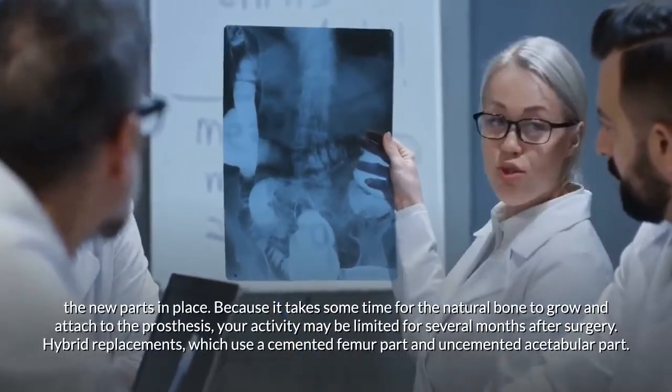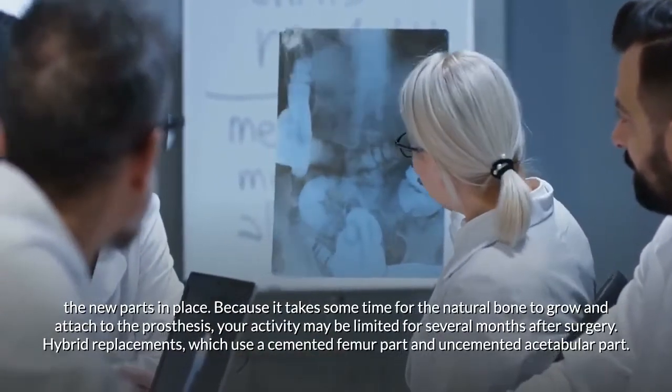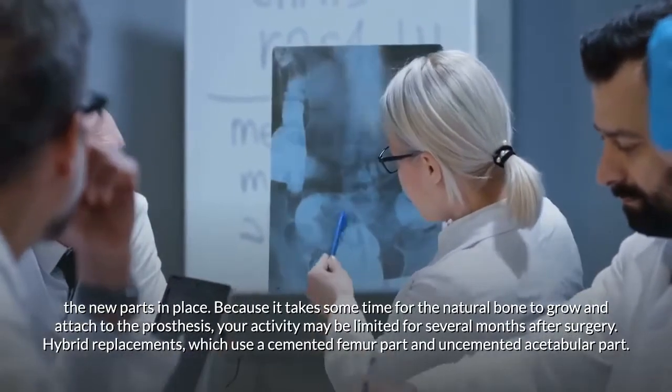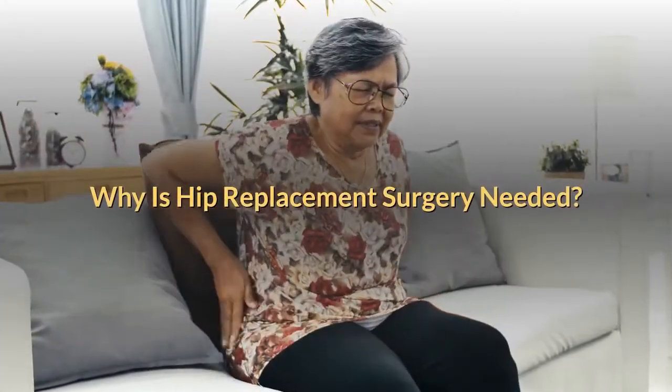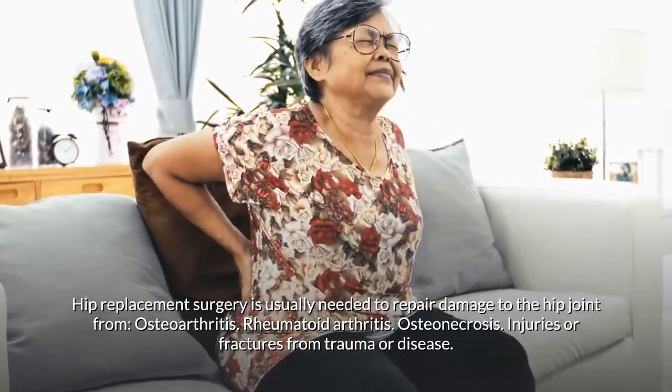Because it takes some time for the natural bone to grow and attach to the prosthesis, your activity may be limited for several months after surgery. Hybrid replacements use a cemented femur part and an uncemented acetabular part.